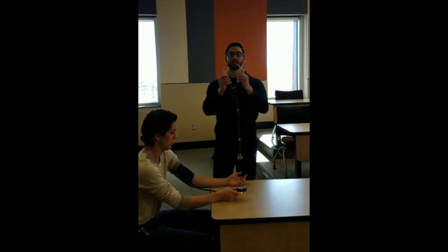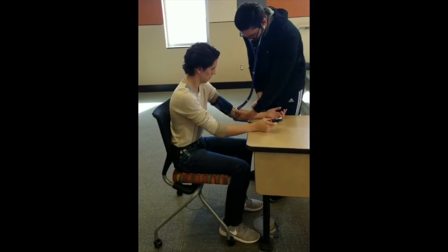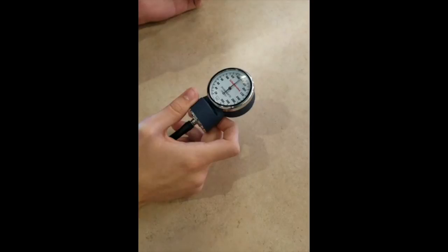Tubings should be facing outward to listen well. Palpate the subject's arm to identify the brachial artery's pulse. Place the chest piece over the brachial artery and inflate the cuff pressure to 200 millimeters of mercury.